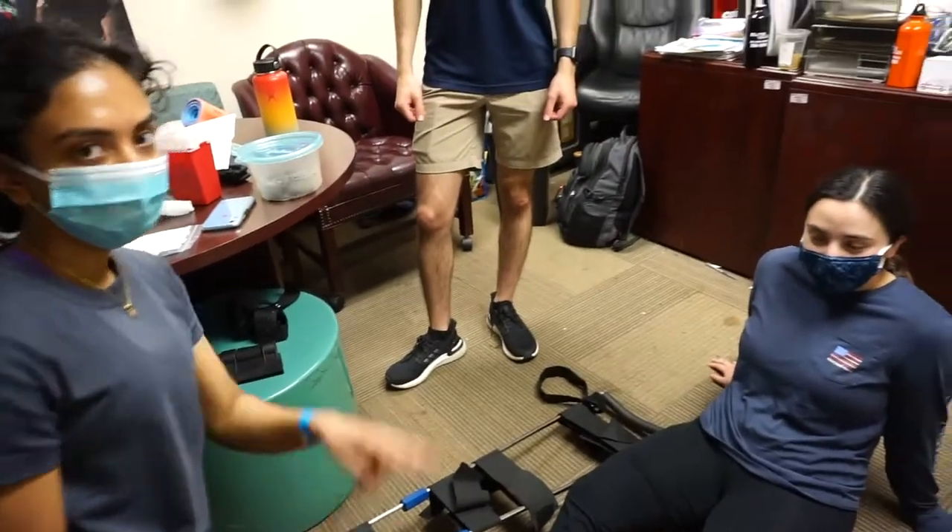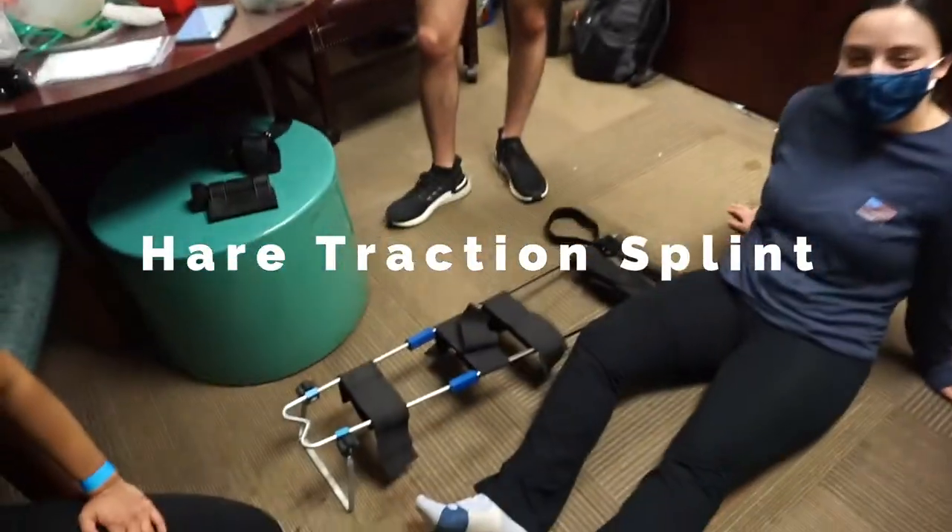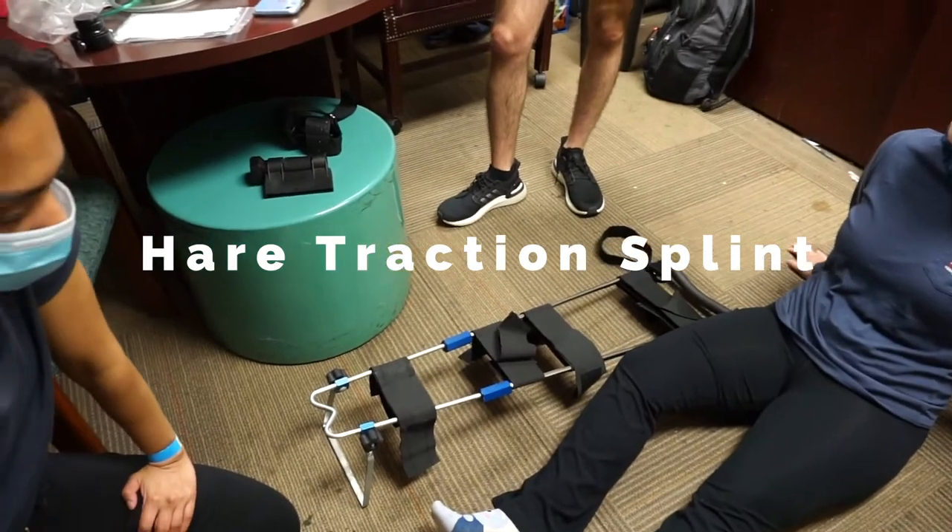What's going on guys? We got Diane, Isabella, Marshall. We're going to demo the hare traction splint.